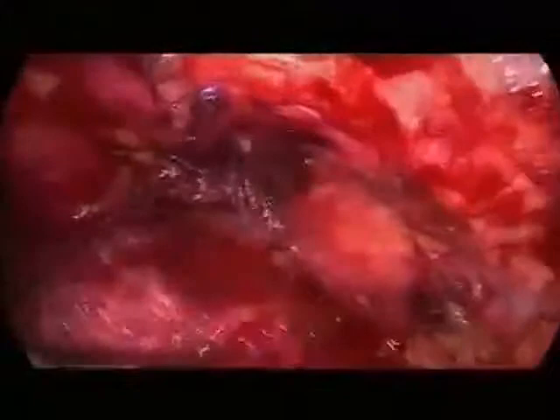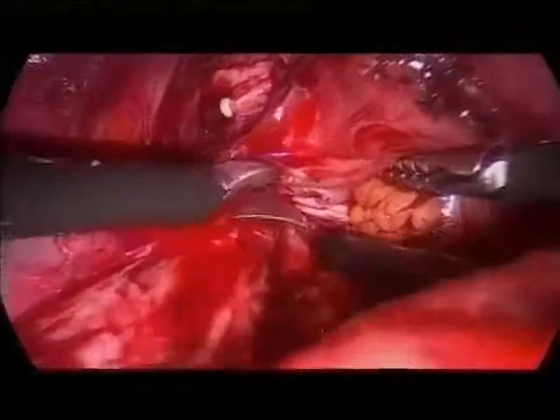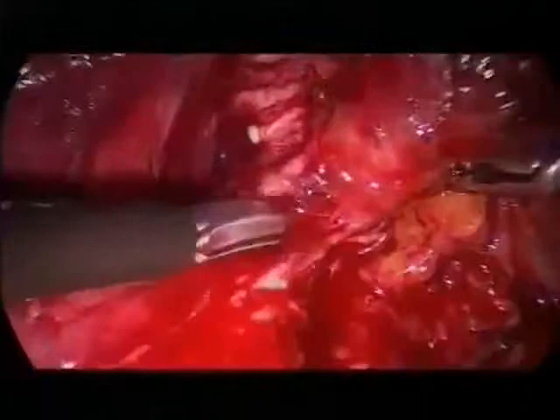You know that. It's a big discussion if there's really such a muscle. I concentrate on the prostate, you know, and all the structures lateral of the prostate, I don't like to touch, however you call it. And I know your anatomical studies, and therefore I was asking. Okay, there's a clip, please.